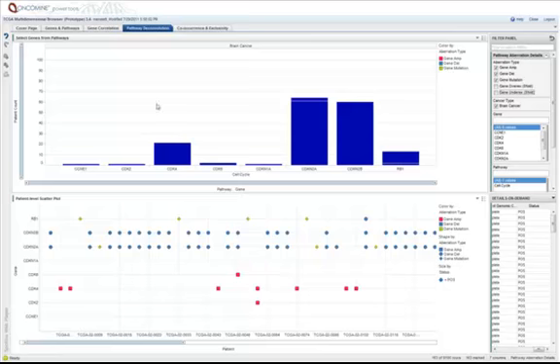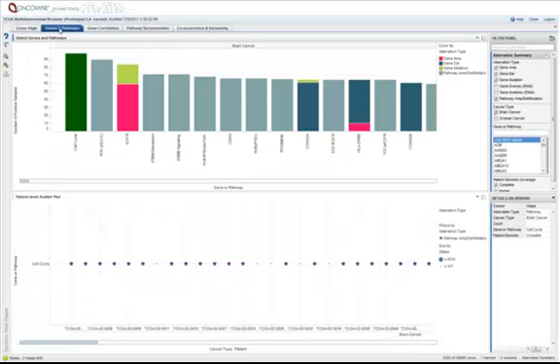Okay, so let's jump back to genes and pathways, and we will do the same sort of pathway deconvolution for receptor tyrosine kinases. So we know from looking at the plot that EGFR is a frequently altered receptor tyrosine kinase, and the difference between EGFR and the pathway as a whole is relatively small. So much of the receptor tyrosine kinase alteration in glioblastoma is due to EGFR. But let's see what other aberrations exist and may contribute to pathway activity.